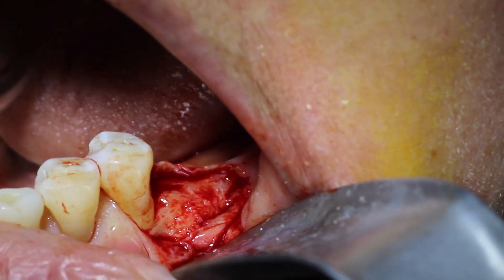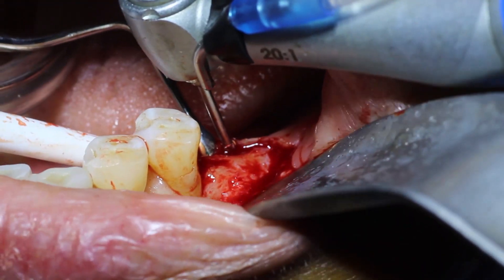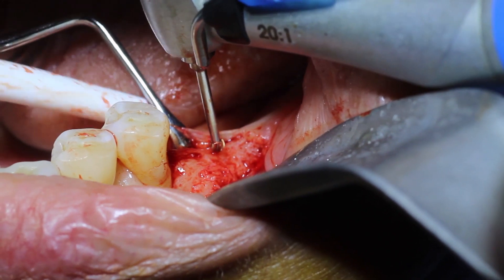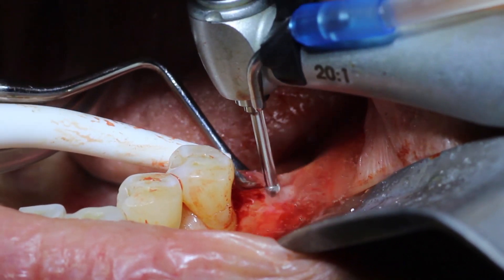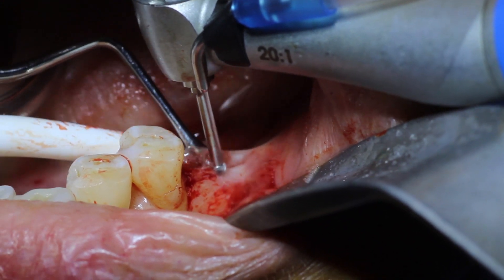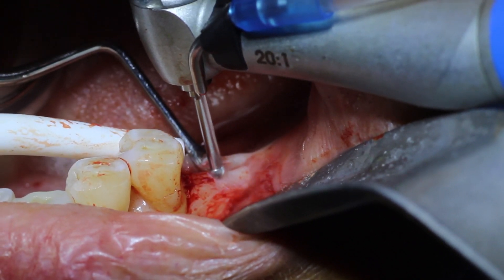There are actually two techniques. One way is to use a large round burr and flatten out the entire area — make a platform for yourself. But a less invasive way is to just take a small round burr like I'm doing here. This is a round pilot burr and I go right in the middle of the ridge.